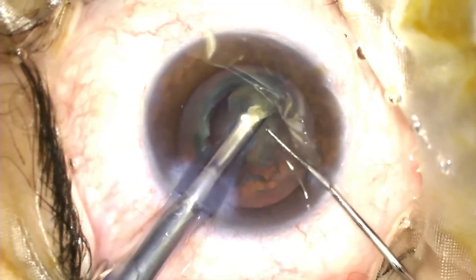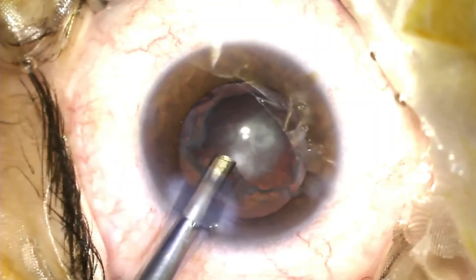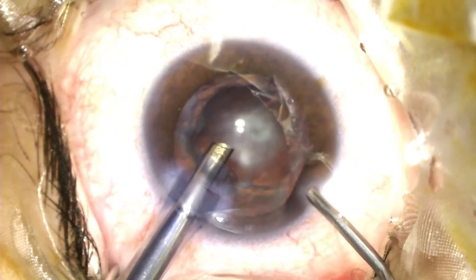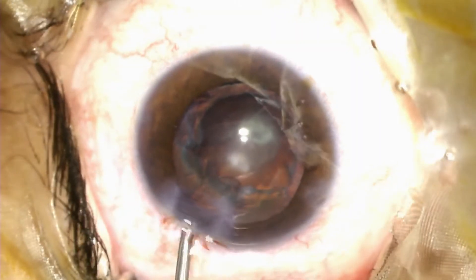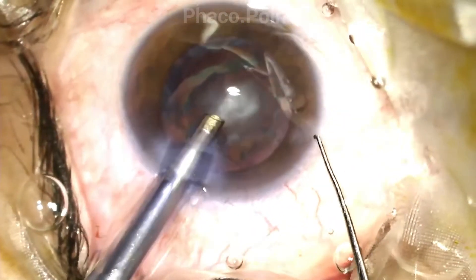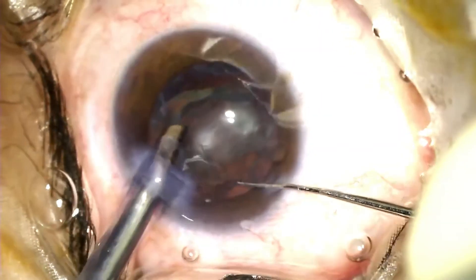As you can see here, by negating the need to actually rotate the nucleus, I've minimized any cause of stress to the capsular bag. Please note how I perform a visco fluid exchange at every step, followed by a visco dissection of the epinucleus, and finally the removal of the epinucleus with the epinucleus mode using the FACO probe.